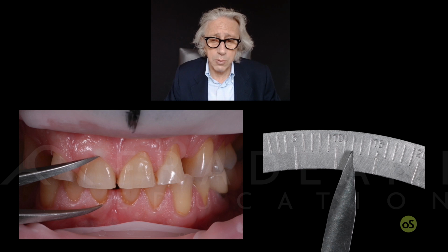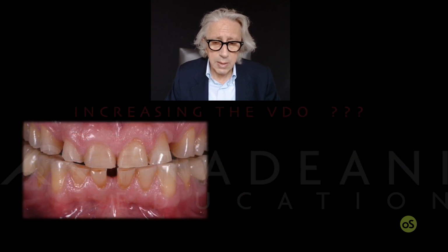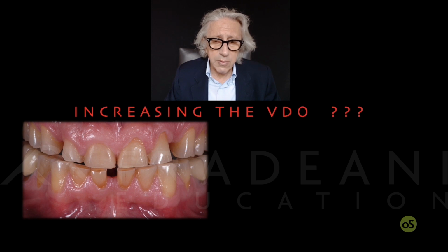Let me check with you how is the height between the 2 arches from central to central incisor. It's like 12 millimeters, like that. We have no other idea if we had a different vertical dimension at the beginning, but we should measure basal bone to judge, not these points over there. So let me tell you, increasing the vertical dimension is necessary 100% in this case. We cannot avoid doing it.